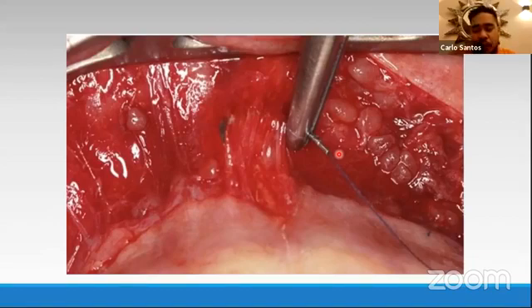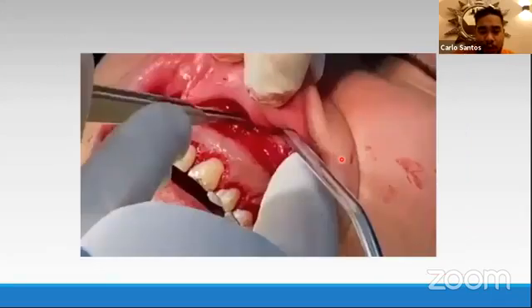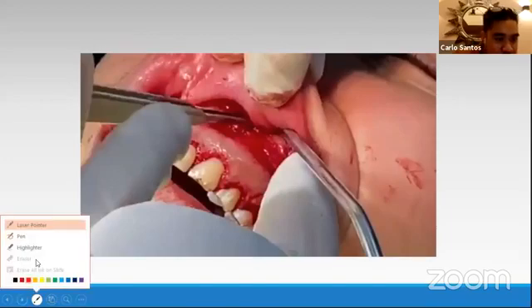So there are actually four muscle groups involved: your oris, your zygomaticus major and minor, and the labii superioris. I will show you. You bundle it in such a way, and it doesn't matter if you don't get the whole muscle. It's impossible to grasp the whole thing. You just restrict its movement. So to show you how it's done, this was done by our participants.